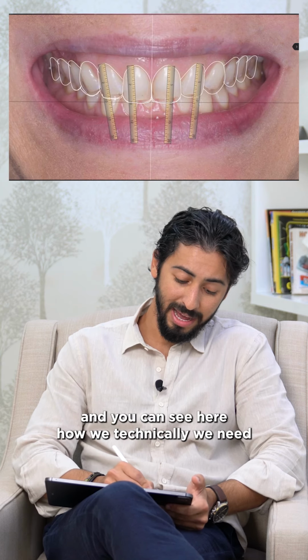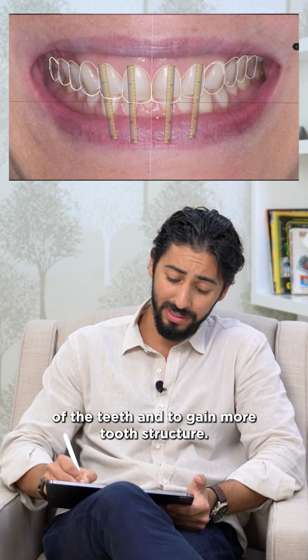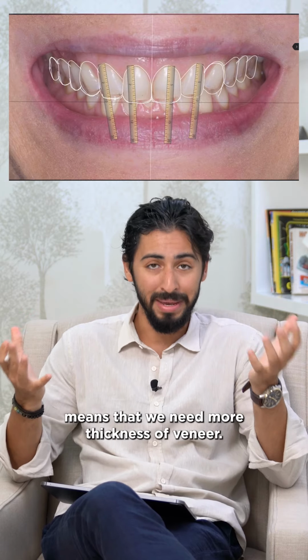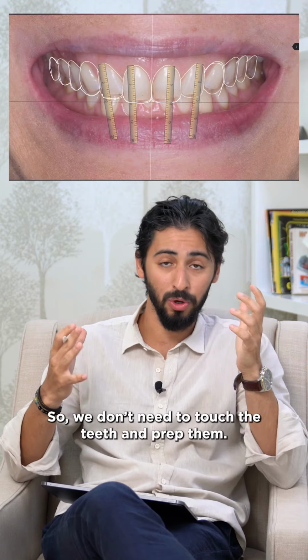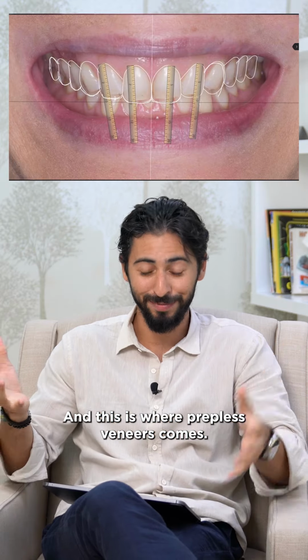And you can see here how we need to increase the volume of the teeth and to gain more tooth structure. And increasing the volume means that we need more thickness of veneer. So we don't need to touch the teeth and prep them. And this is where Prepless veneers come in.